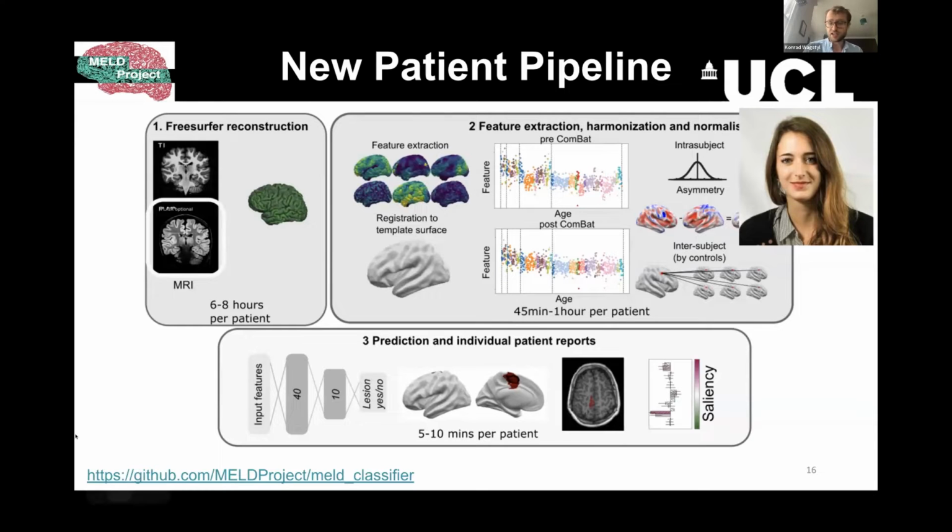The first is FreeSurfer, which I think Carolina said you covered some of. It's quite a slow step because FreeSurfer is quite slow. We have an option to run it with FastSurfer if you install FastSurfer, and that speeds this up to about an hour. Some people prefer using FreeSurfer. They think the results are a bit better, but you have that time point that you have to deal with.